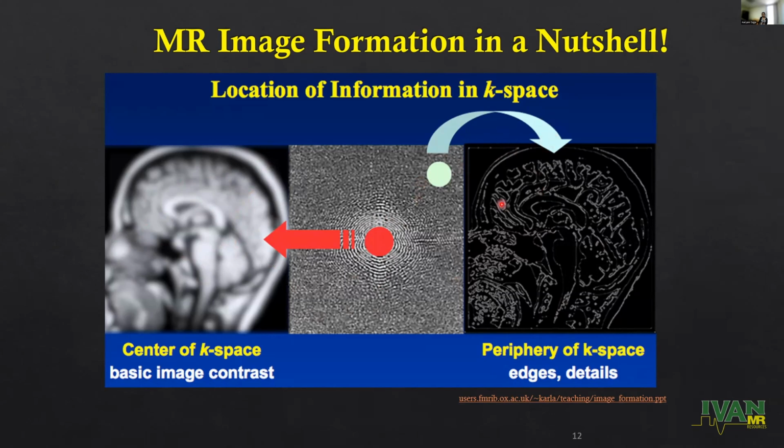So why I'm saying all this: in UTE, we are acquiring more at the center and less at the periphery. The advantage is that it helps to be motion insensitive, because with the oversampling, you're averaging the motion. In the liver world, in the abdomen, the patient has to hold their breath to get the scan, because if you're breathing, the breathing motion would cause motion artifacts.